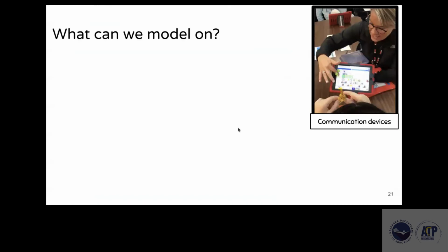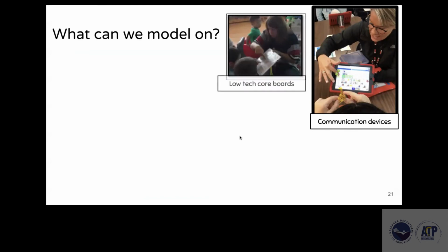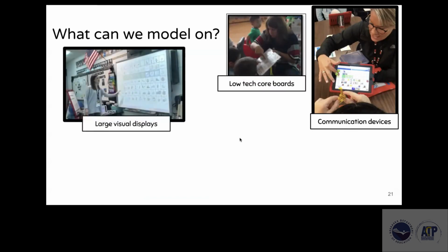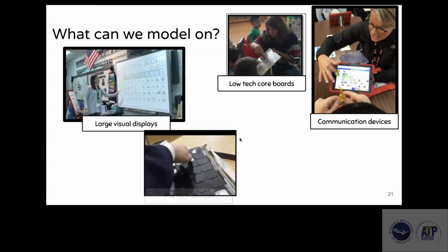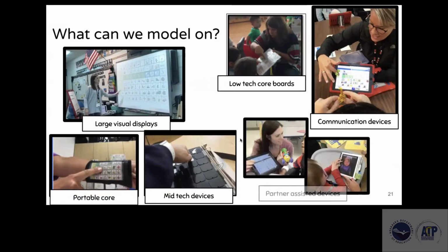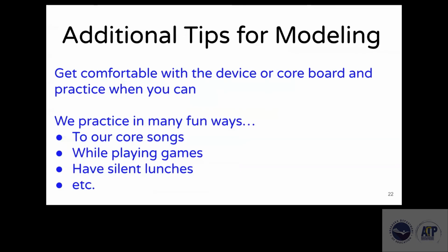So what can we model on? We can model on communication devices, low-tech core boards, large visual displays, mid-tech devices, portable core, and we also have partner-assisted devices. Whatever the student's using, it's very important to use it to talk to them.